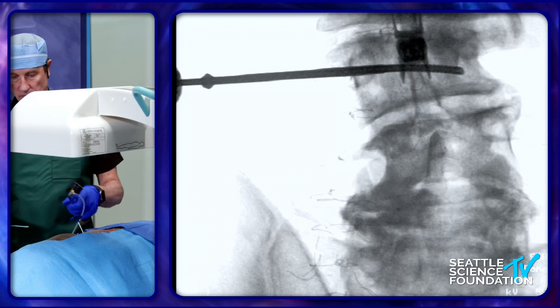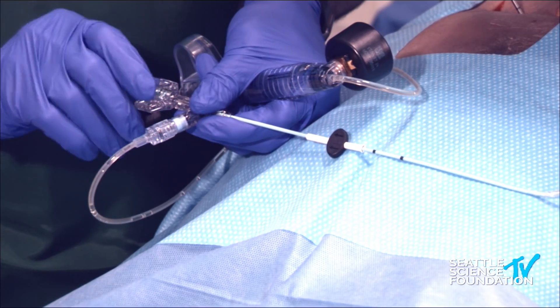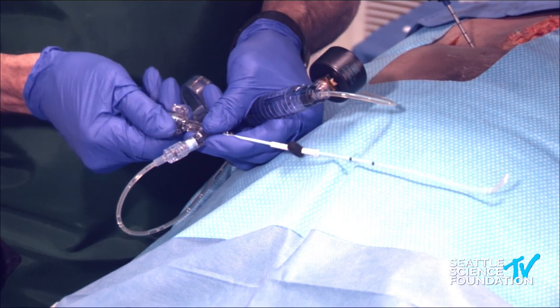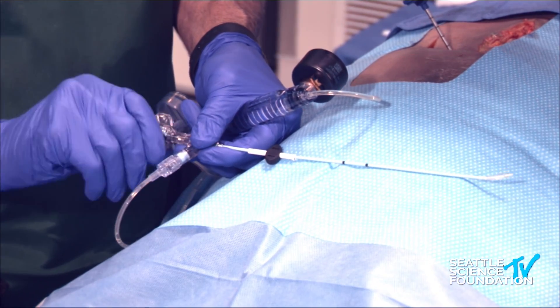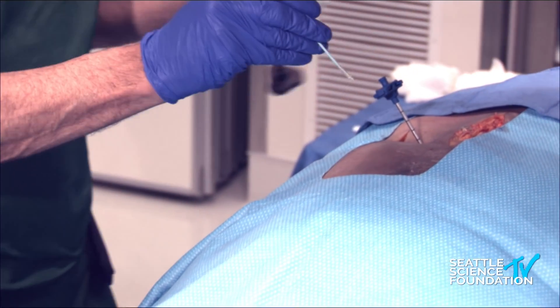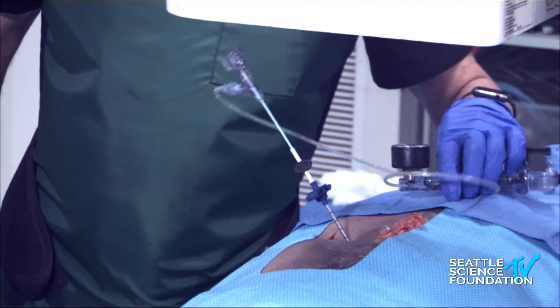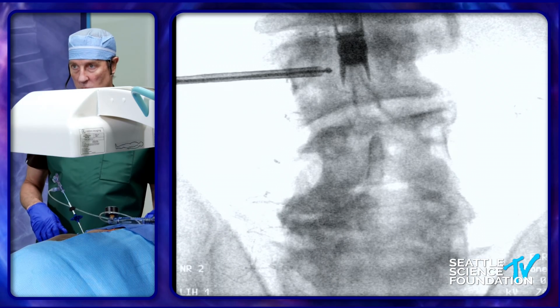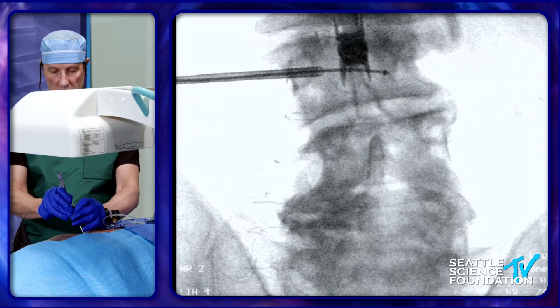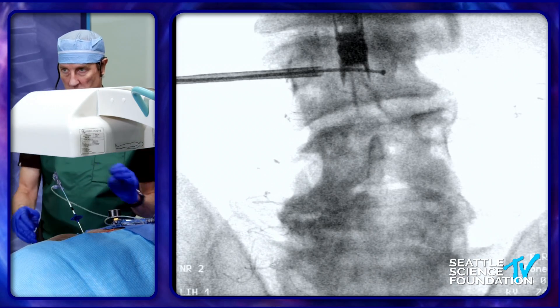So — Arcadia balloon. This balloon is steerable, same as what follows the power curve. It's got marker bands, and it's a very low compliance balloon. You turn the knob clockwise and it goes to the exact same curve on the distal tip as the power curve — it's design-matched and size-matched. It's a very low compliance balloon with lots of power, designed to be placed under AP guidance. It will follow the pathway, and sometimes you need to give it a little bit of turn to follow the pathway. We're going to get our marker bands centered in the center of the vertebral body, about right there.